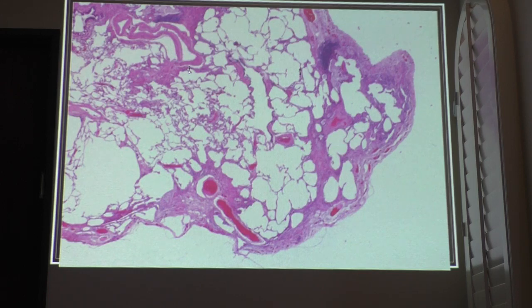It's almost like it's very patchy. They also get, I think, thickening of the arteries. There's a vessel there towards the top left corner. Right in the top corner, you can see an airway, and then you'll have the artery and vein run right near it. So you have the airway, and then that's an artery, and then a vein.